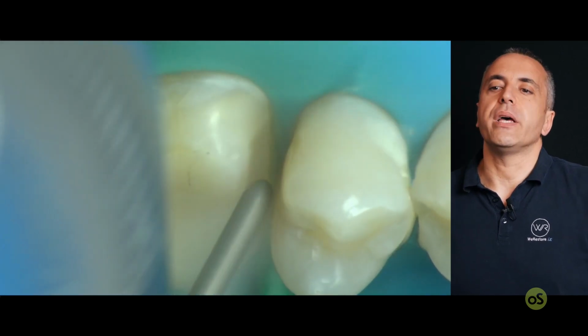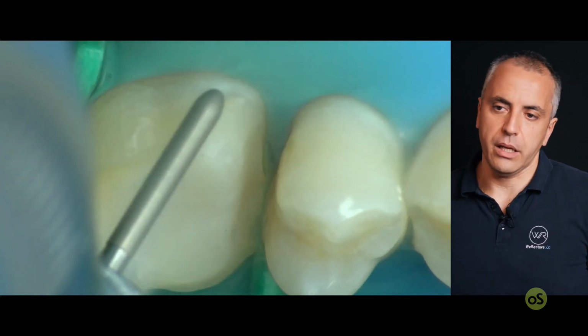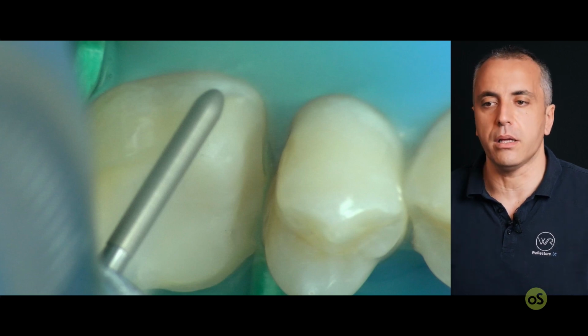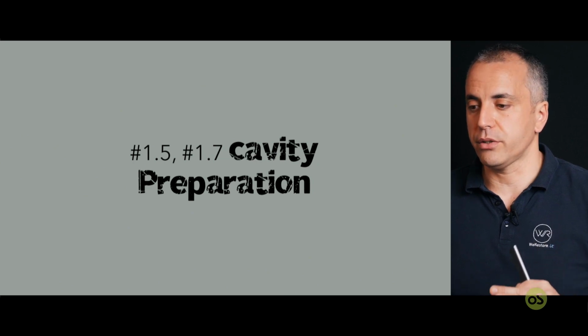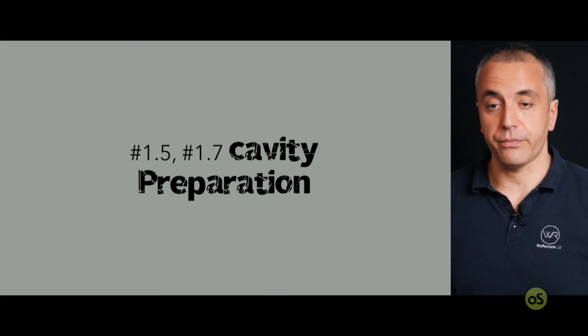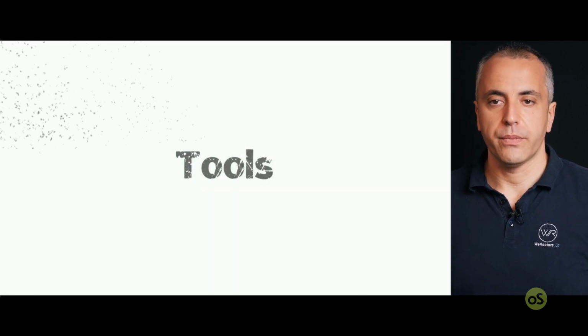What about the margin? The margin on the tooth is completely on enamel except on the mesial part that is in composite. As I said, it is a margin relocation. So now let's move to the other two treatments. Before the impression, we have to finish the direct restorations. So we have to prepare the class 2 on the second premolar and the slot preparation on the second molar. What do we need? The tools. Here they are.